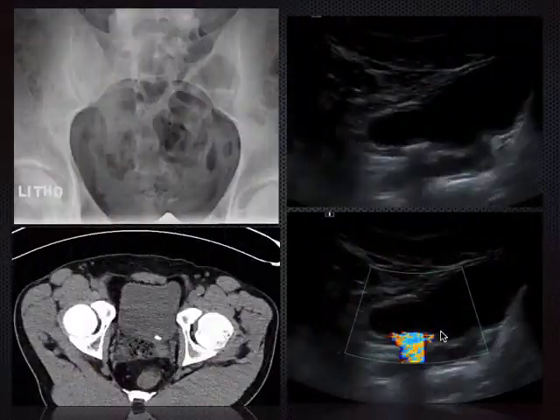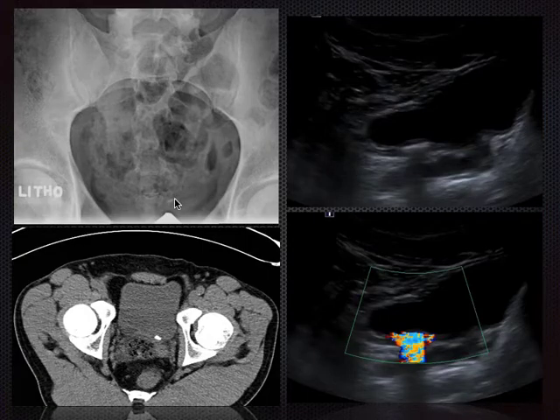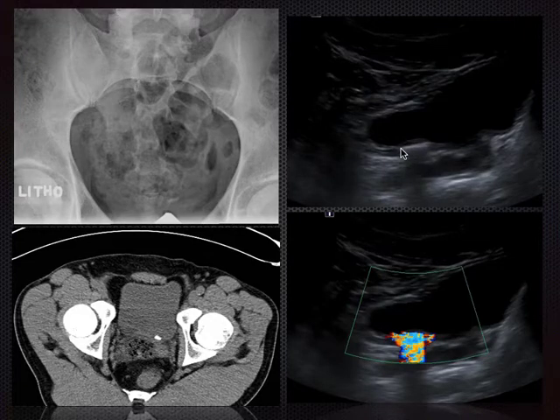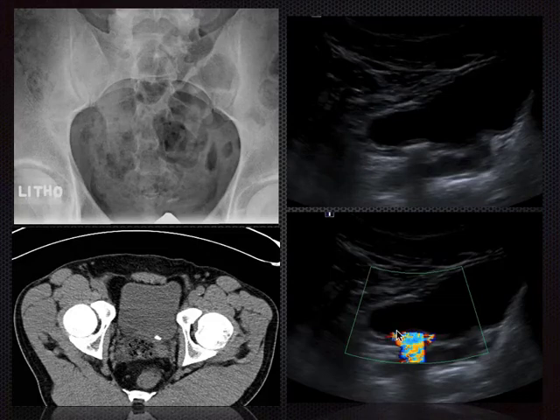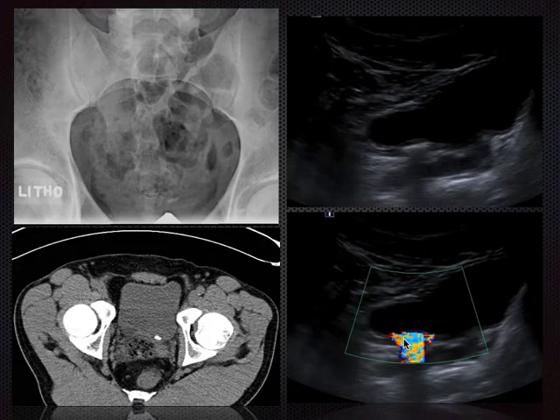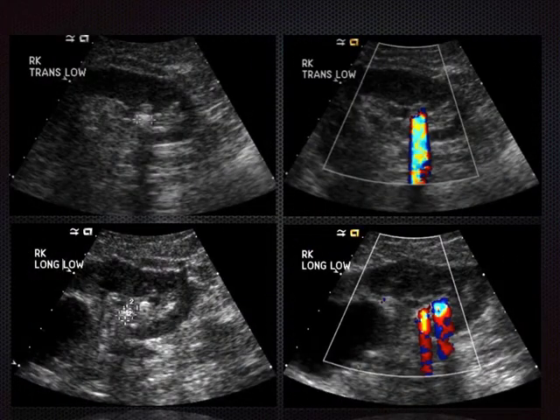Here's an example of what a stone in the ureter looks like on ultrasound—you can see it distally in the UVJ. The correlative CT clearly shows the stone in the ureter. This is the twinkle artifact—it produces a color mosaic appearance when you turn on the power Doppler. You can't rely on the twinkle artifact to measure stone size because it's typically larger than the stone itself, but it's a great way of localizing calculi and improving radiologist confidence.